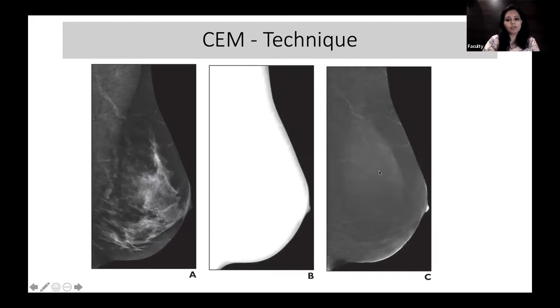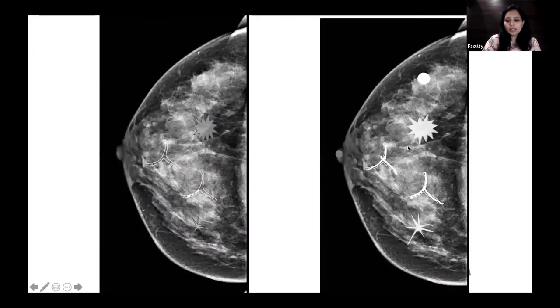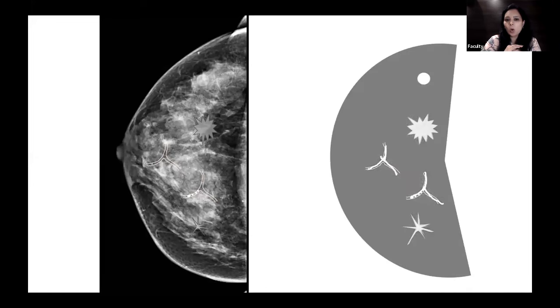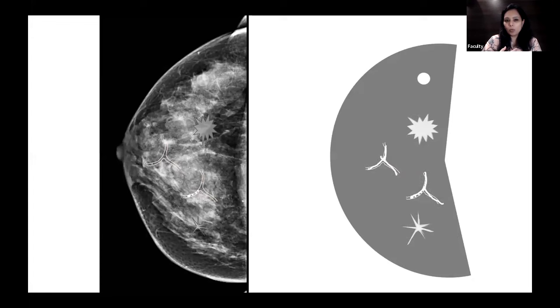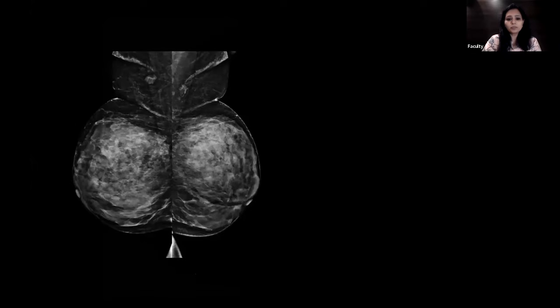On the recombined image, abnormalities such as speculated or non-speculated masses, calcified or non-calcified DCIS, and architectural distortion are all visualized. The recombined image suppresses the whole background parenchymal tissue, and all enhancing abnormalities — non-speculated masses, speculated masses, calcified or non-calcified DCIS, and enhancing architectural distortion — stand out clearly.